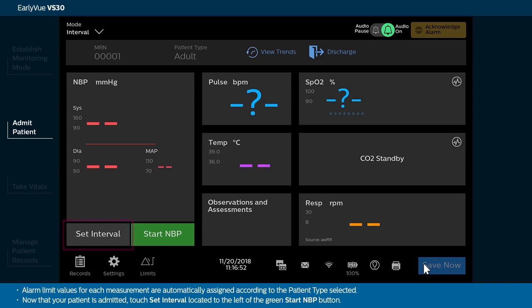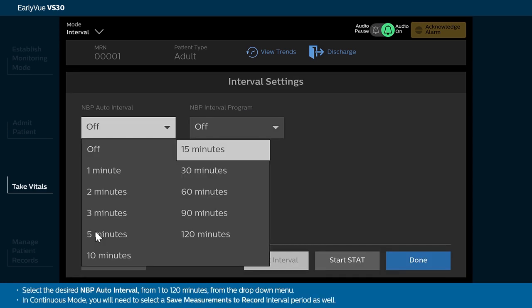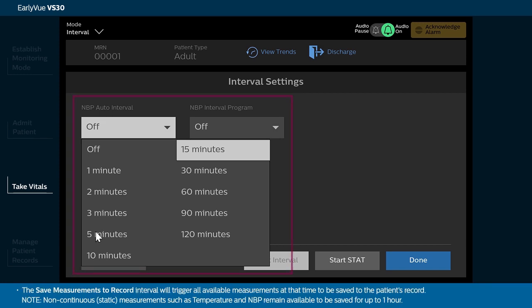Now that your patient is admitted, touch Set Interval located to the left of the green Start NBP button. Select the desired NBP auto interval from 1 to 120 minutes from the drop-down menu. In continuous mode, you will need to select a Save Measurements to Record interval period as well.